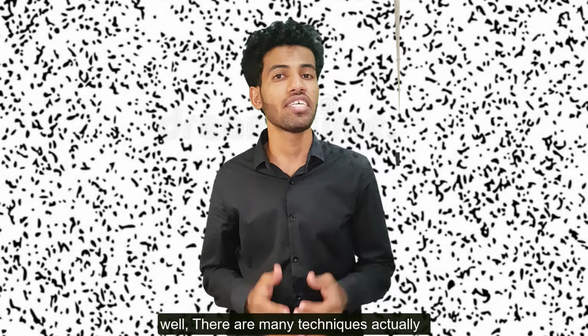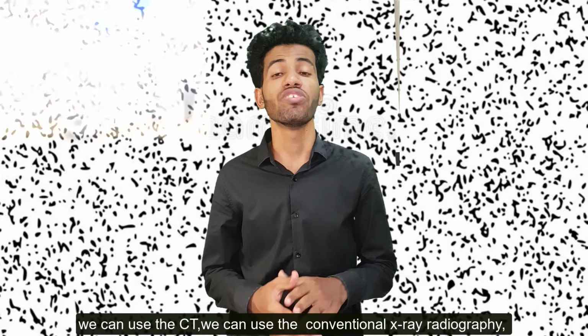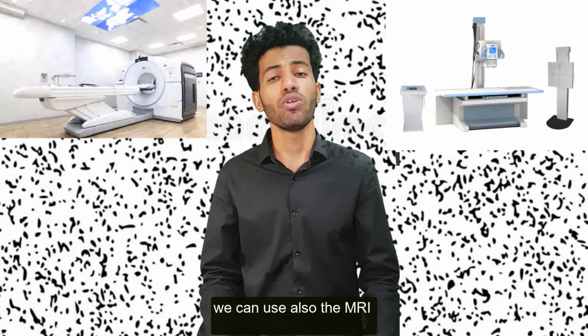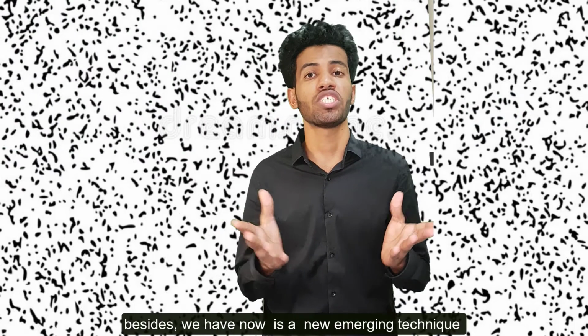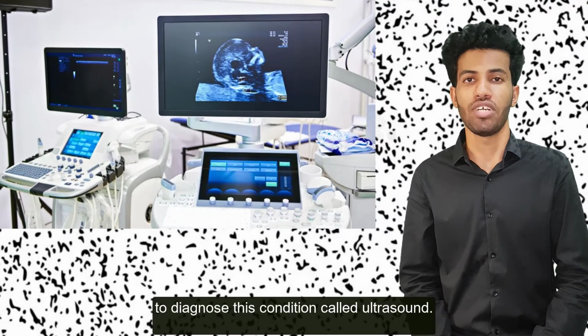How can we diagnose this disease in patients? Well, there are actually many techniques to diagnose this condition. We can use CT, we can use conventional X-ray radiography, and we can also use MRI. Besides this, we now have a new emerging technique to diagnose this condition called ultrasound.